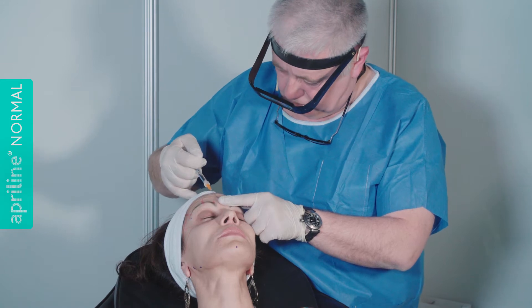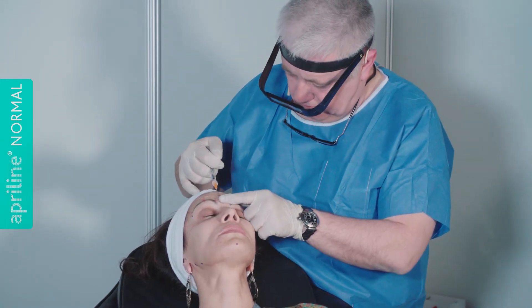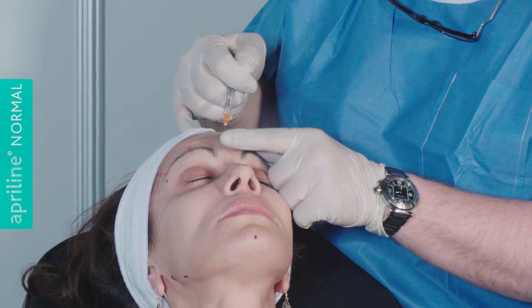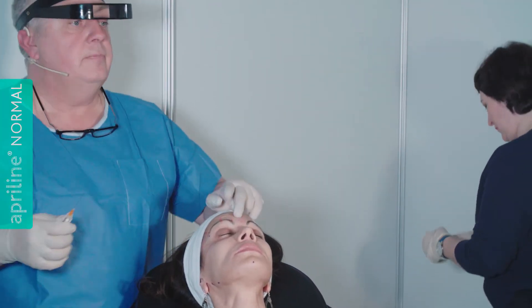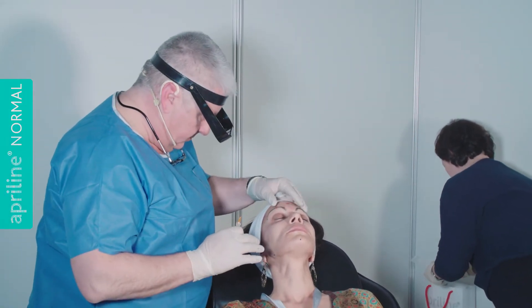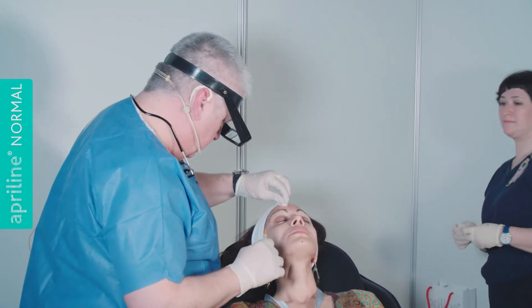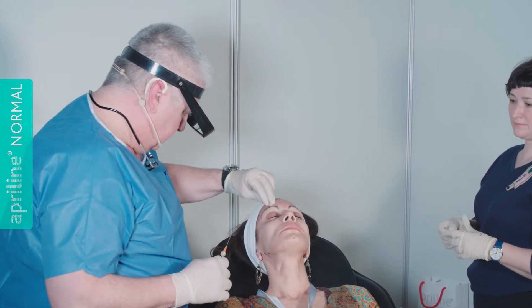Without any neurotoxin, I will inject and correct. If you make the little dissection like I did, you separate the skin and the muscles — that's why after when she contracts there are less wrinkles, because you created a plane between the muscles and the skin.